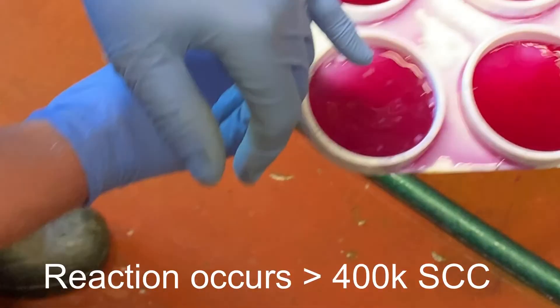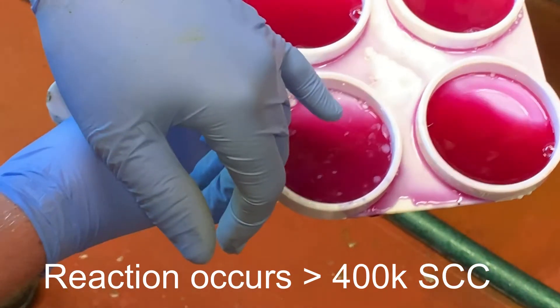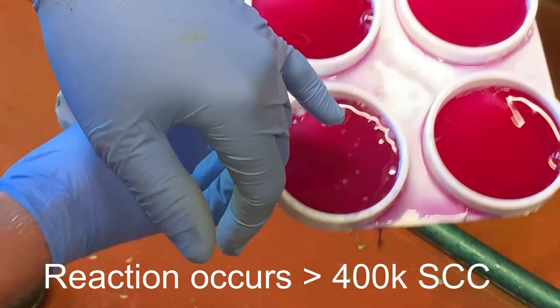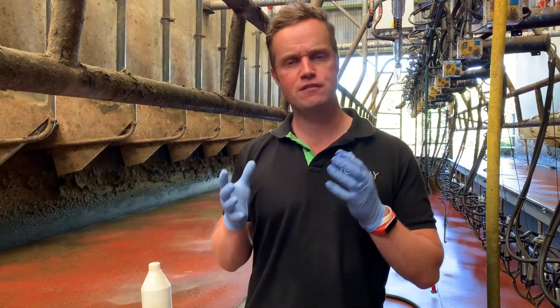A gelling reaction indicates there's infection in that quarter — over 400,000 somatic cells. The reagent is reacting with white blood cells, which causes the gelling. The more gelling you have, the higher the cell count. It's a tool you need to get used to yourself to become comfortable with, and it's very valuable on farm.